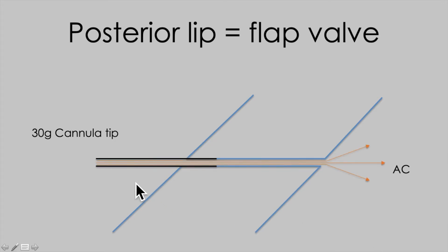If you float into the entry site about 10 to 20% into it — just kissing the external ostium as you inject — fluid pressure is going to hold the interior aspect of the wound open and allow you to fill the anterior chamber.